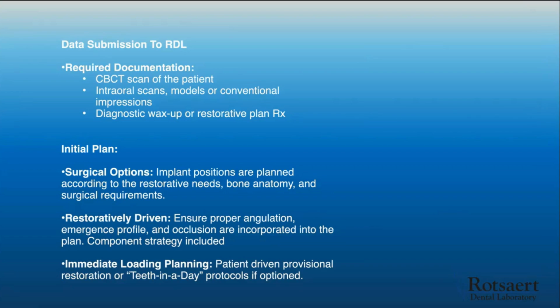So once we have everything we need, we'll design it. And usually we ask for a few days, probably 3 days for the turnaround time, and then 5 days for the printing, just to make sure we have everything. Sometimes we have to order in the sleeves, but usually we know that when we're doing the plan.